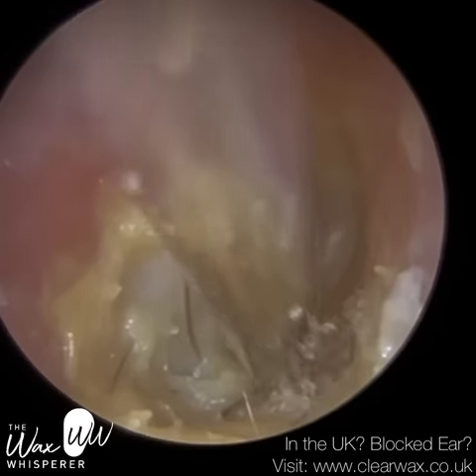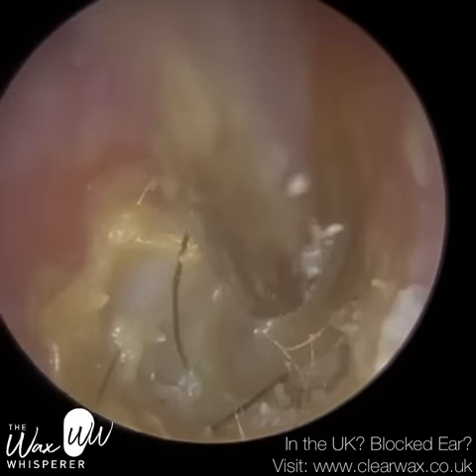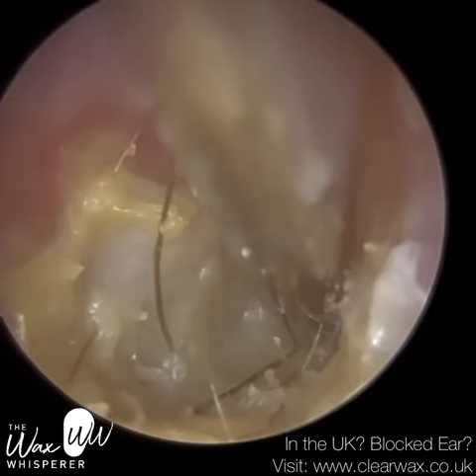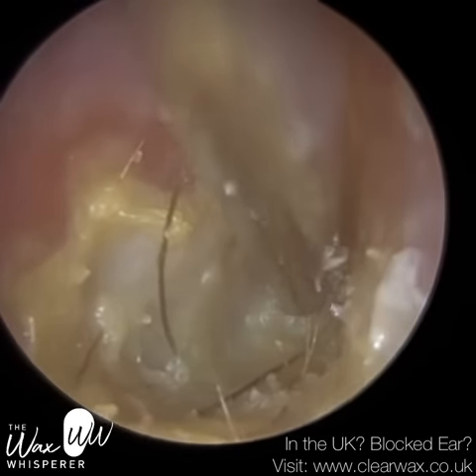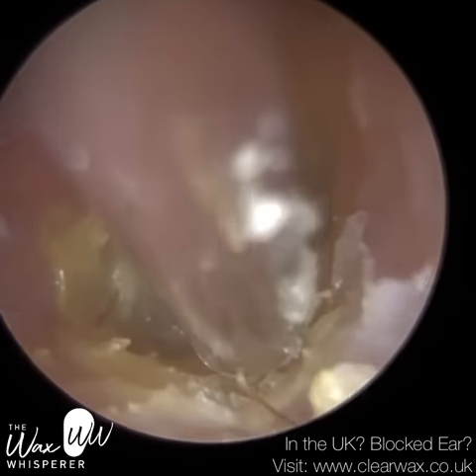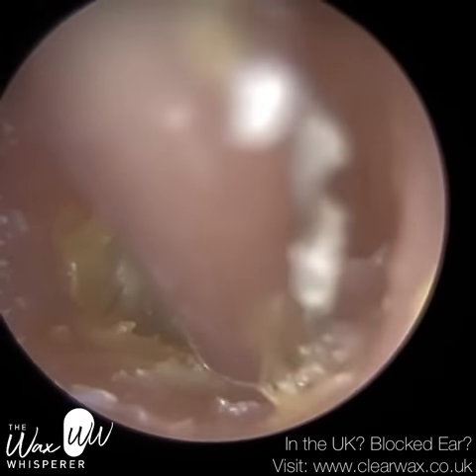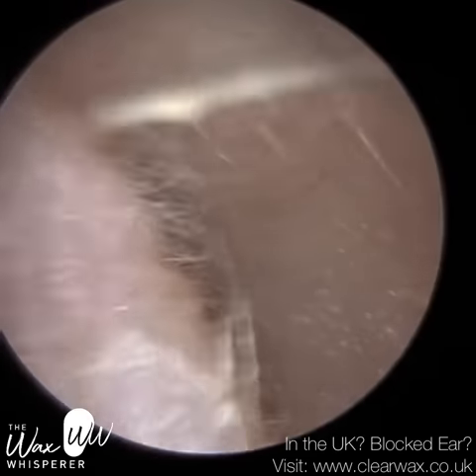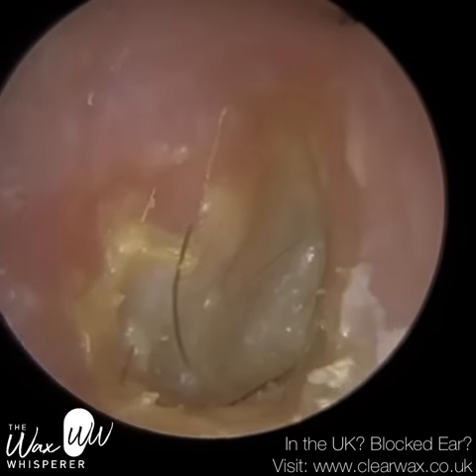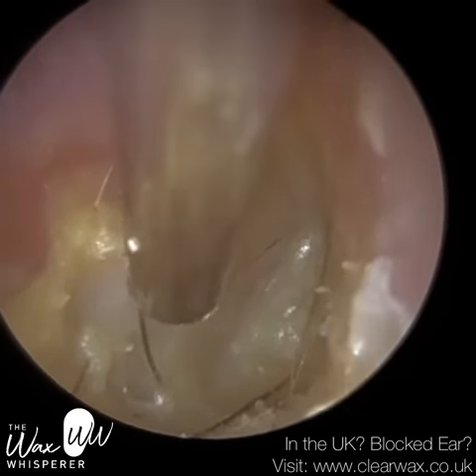I'm just using the fine end here again to get this off the floor of the eardrum — this is called the inferior recess. As we approach the eardrum, the ear canal narrows and we call that narrowing an isthmus. You can probably just see right to the suction probe where the ear canal narrows and then widens again. Similarly, as we approach the eardrum, the ear canal at the base goes upwards and then downwards. That narrowing and widening creates two recesses — one called the inferior recess, which is a trench on the floor of the eardrum, and also an alcove to the right-hand side of the eardrum in the case of the right ear.